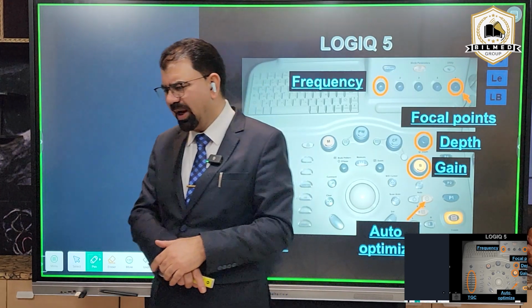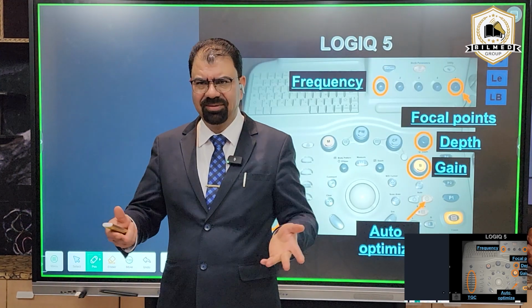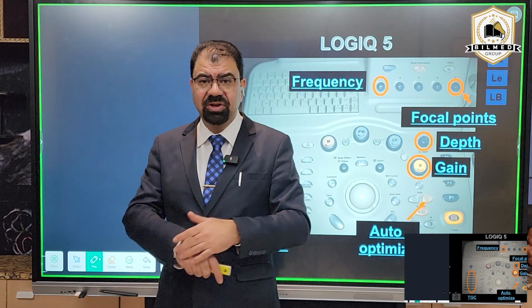I don't love to have a one-sided lecture. I'm not a lecturer. So we are here to discuss, because discussion only will make you understand what we are talking about.